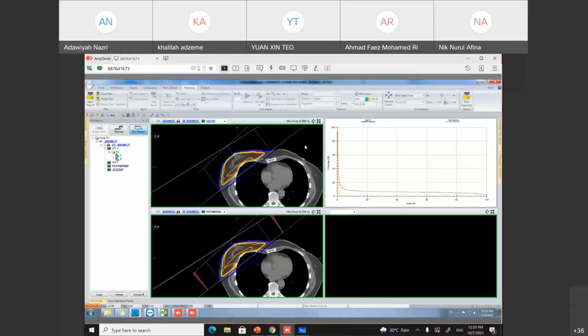So I hope this helps; the concept is just an IMRT concept, using MLC segmentation to reduce the hotspot. I hope you can learn this and remember this technique, and maybe next time when you go to other centers, I hope they already apply this technique.